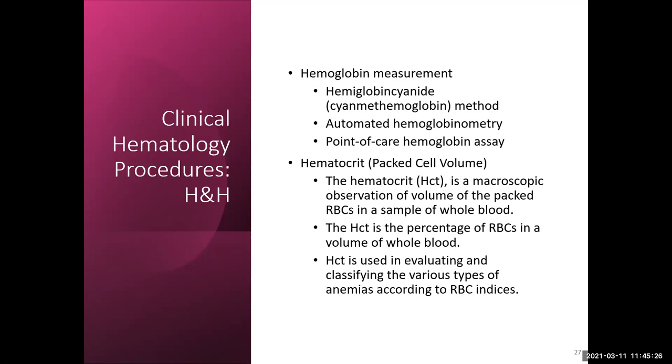Your hematocrit, which is also known as a packed cell volume, can be a macroscopic observation where you do that spun hematocrit, what you are doing in your hematology one class. You'll get to do that. It could be a calculation. There are several methods, depending on the manufacturer and the analyzer, of how they do that measurement for hemoglobin and hematocrit.